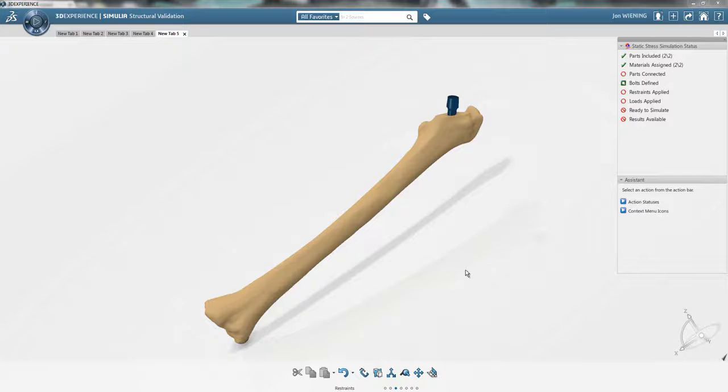Here we have an assembly of a femur bone and a hip implant device. And our goal is to determine how well this particular implant design is going to work in service. So we'll test it virtually inside of Simulia Structural Validation.